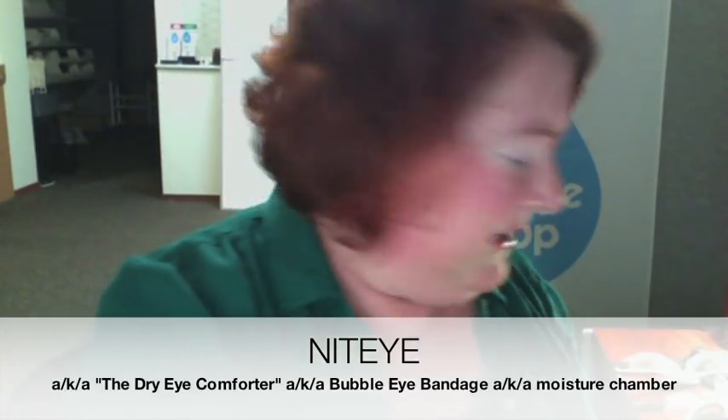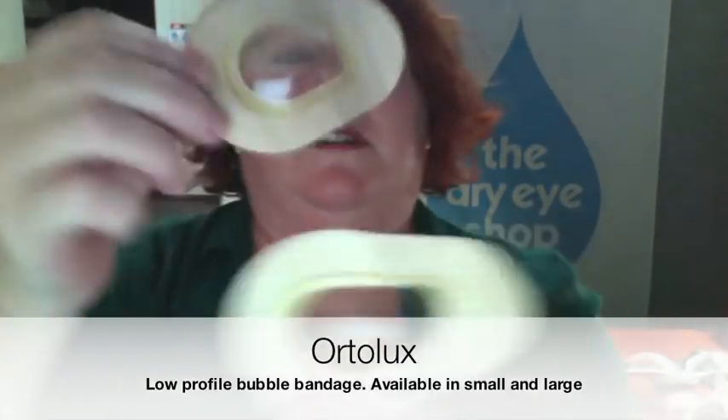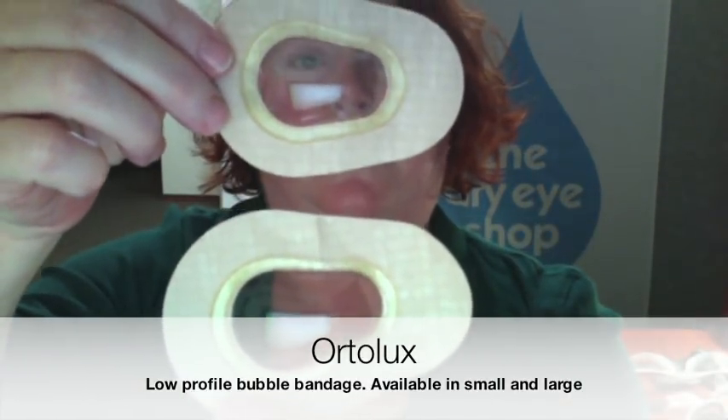So that was the Nite Eye. The next one is the Ortolux bandage. This one comes in two sizes — there's a small and a large. This is actually a better-designed product; it just has a horrible adhesive, but the actual bubble part of it is great because it's lower profile.